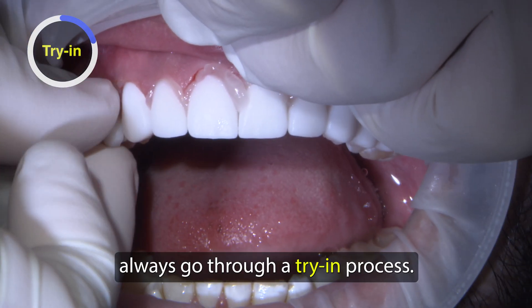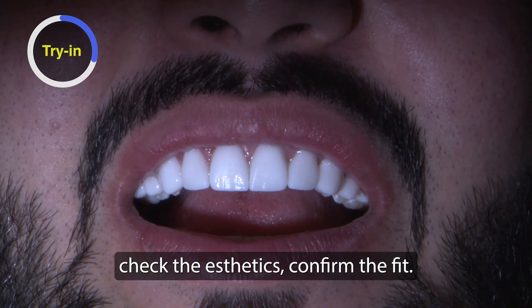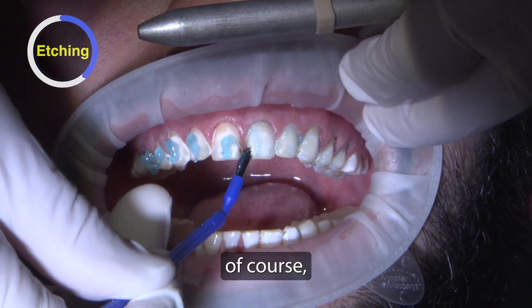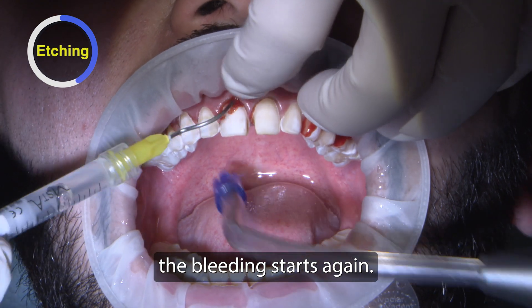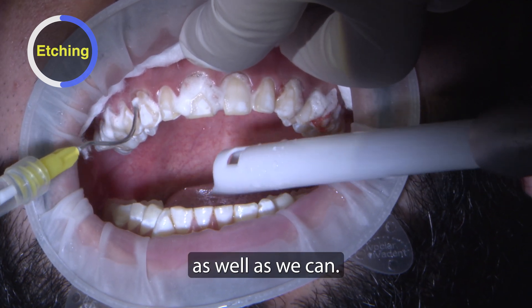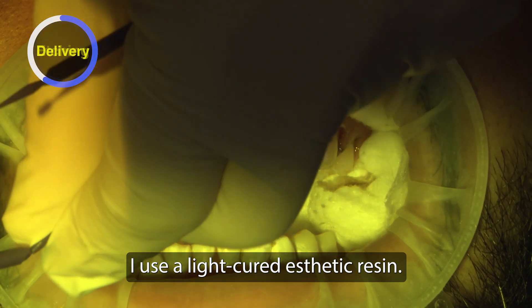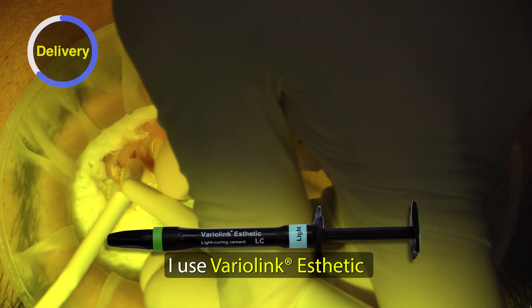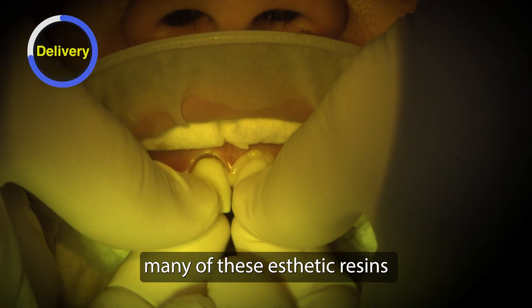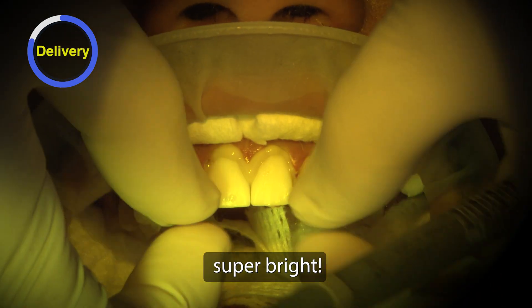For these veneers, I always go through a try-in process — using try-in gel to check the fit and aesthetics, then confirm the fit. Now we go through our bonding protocol. We drop our phosphoric acid on and spread it out. After you etch the teeth, the bleeding starts again — so I just go through a hemostatic process again, flush off as well as we can, and isolate. For all veneer cases, I use a light-cured aesthetic resin. For this case, I use VaryLink Aesthetic. There's a warm plus — many of these aesthetic resins come in different chromas. I use the warmest one because this bleach shade is super bright, and I wanted a little warmth coming through. Usually I use a mixture of clear and white.